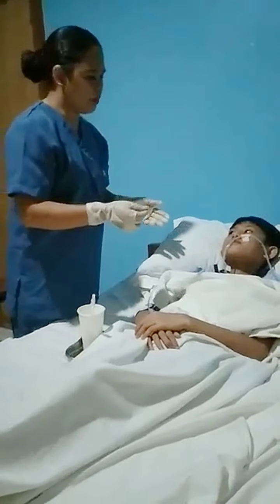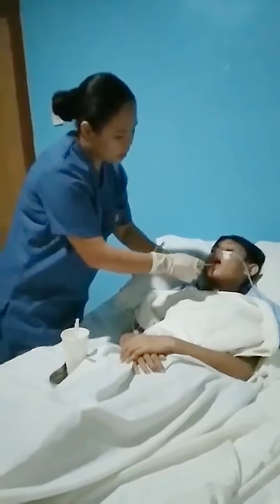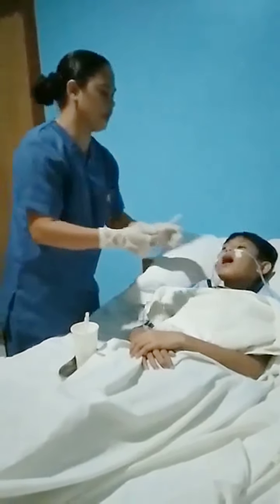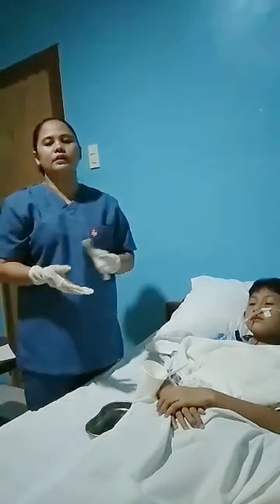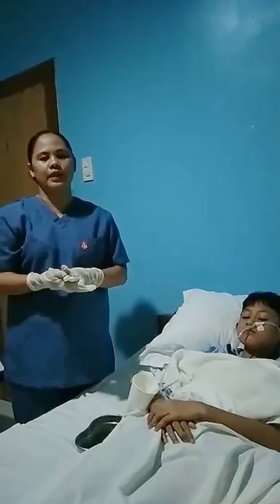So Ryan, please open your mouth. Okay, let's see if the tube is in. Okay, alright. Good. So after doing that, we may now proceed with the other ways of verifying our placement.